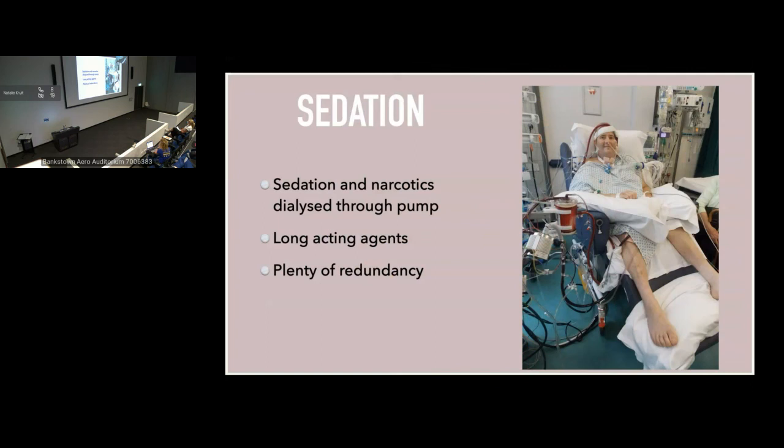And basically, the incidence of ICH is around 20% on ECMO, so you want to be really careful. Some centres aren't heparinizing at all until they do a pan-CT scan. Others are just doing this very low sweep until they know what's going on and have a feel for the patient.